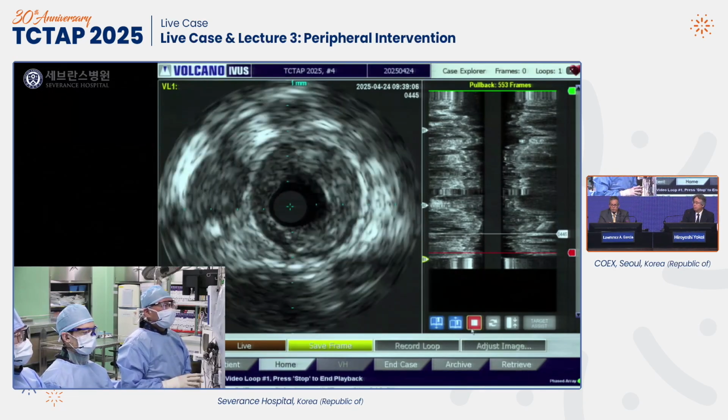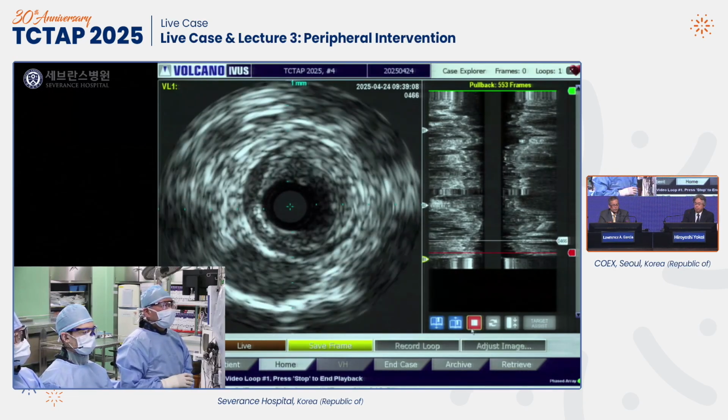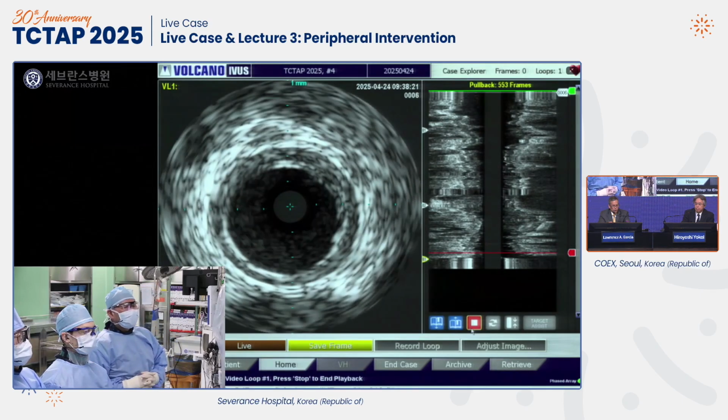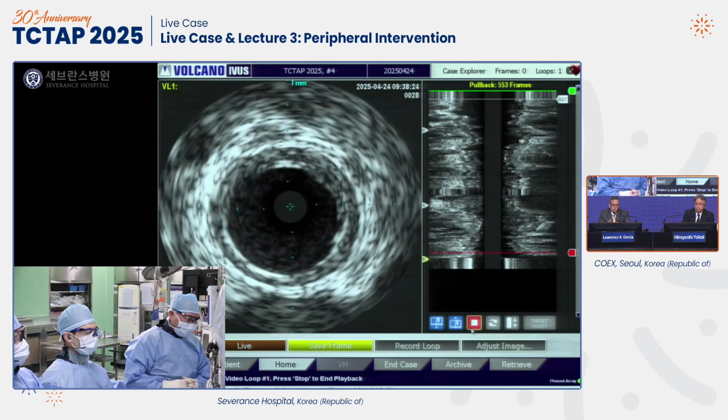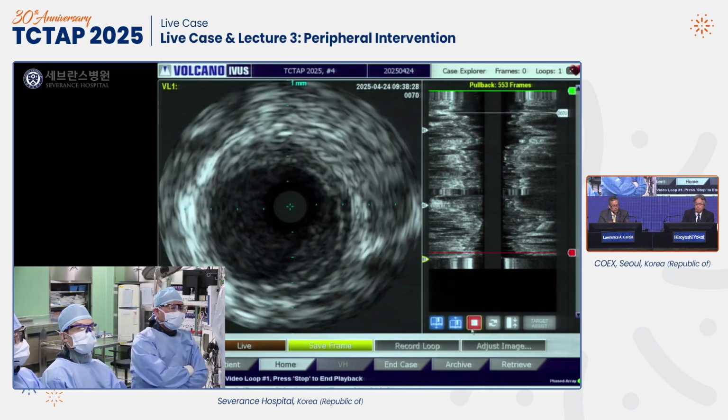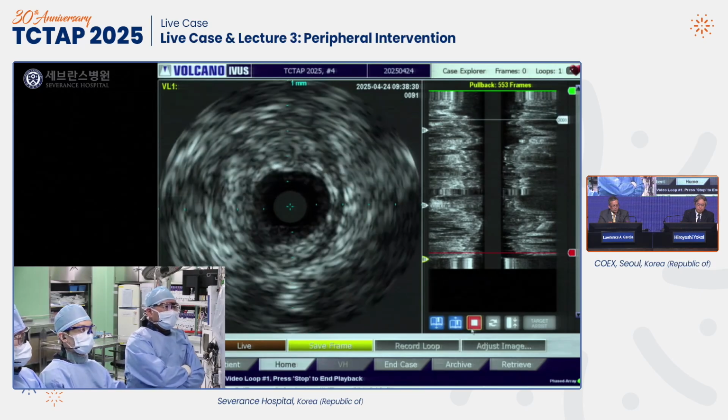But before we can go back and forth on the panel, do you want to continue there, Dr. Ko? What's going to be your plan? What atherectomy device do you want to use? And are you just a heparin person at this point now that you've externalized and integrated your wire? What are your next steps?